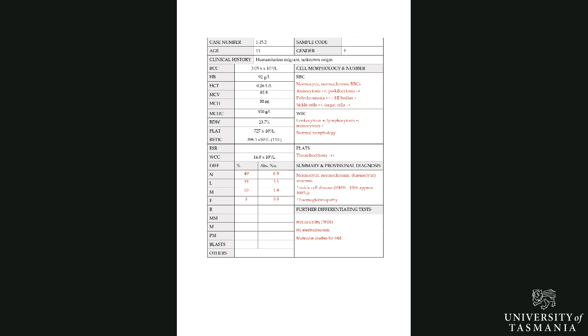So we've got quite substantial anisocytosis that we would expect to see on the blood film. And the reticulocyte count is 13%. I must admit, I tend to go with the percent rather than the absolutes, although our normal absolute has a top of about 100 times 10 to the 9th per litre. So you can see that the retic count is substantially increased whichever way you look at it.